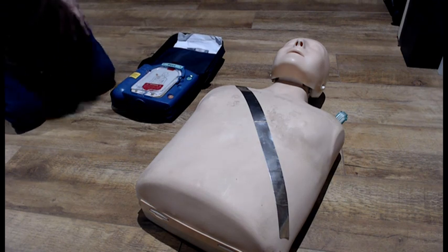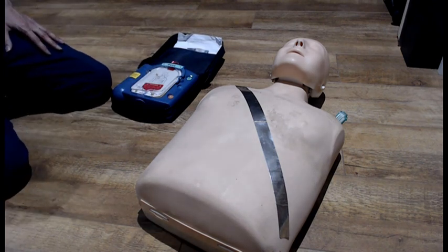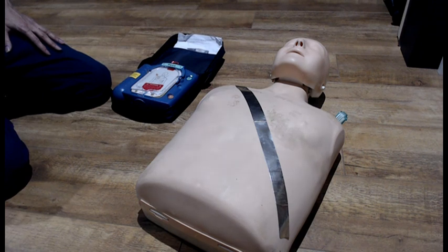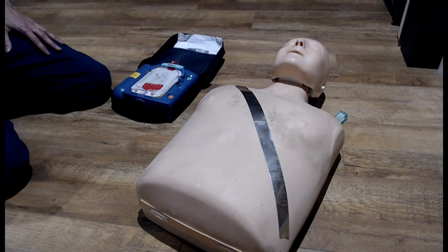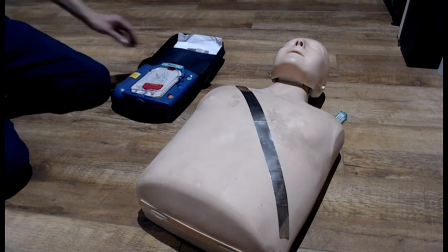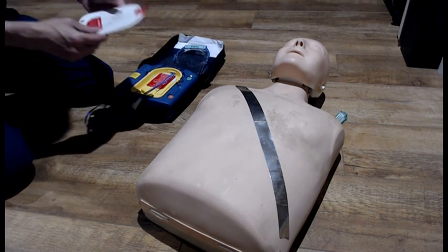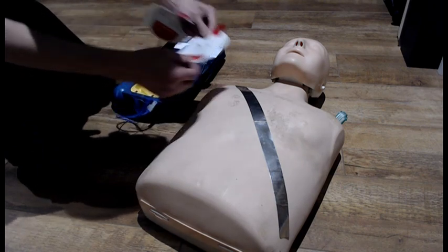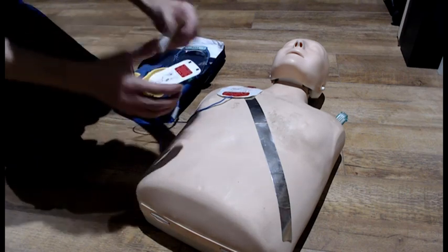Start by removing all clothing from the patient's chest. Cut clothing if needed. When the patient's chest is bare, remove the protective cover and take out the white adhesive pads. Look carefully at the pictures on the white adhesive pads. Place each pad exactly as shown in the picture, and press firmly to the patient's skin.